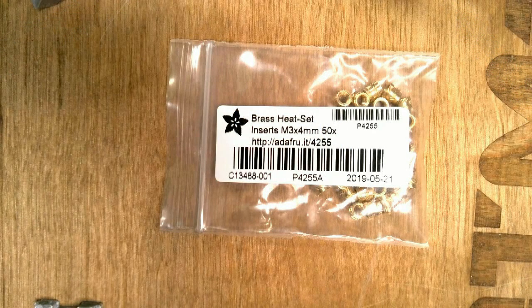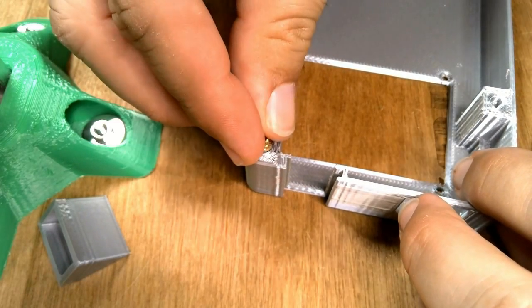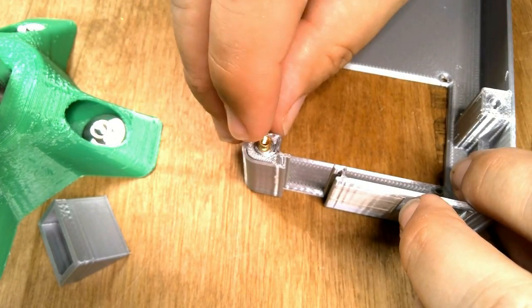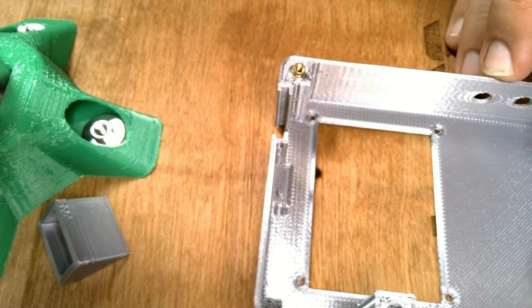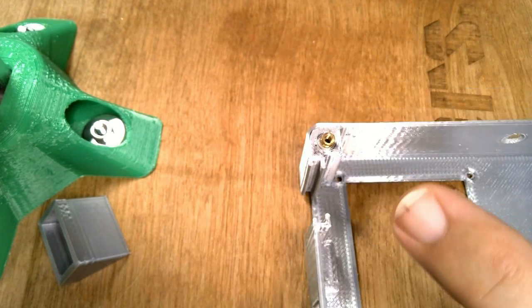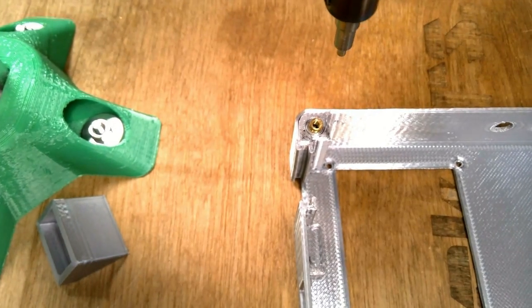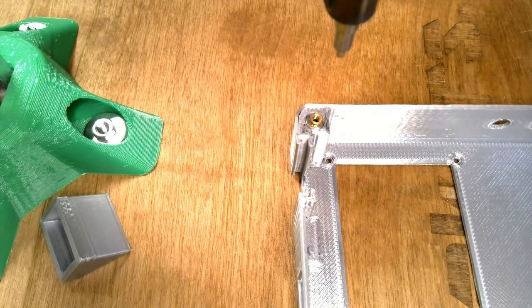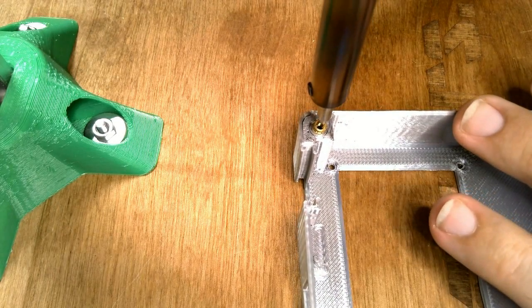We will prepare the case by inserting 4 of these brass heat-set inserts for M3 screws. The inserts go in 4 locations on the case. Press the brass insert into the hole in the case, and then, using a hot soldering iron with a special heat-set insert tip, press it into the case. If your soldering iron is too hot, try unplugging it and letting it cool for a minute, and then press the insert into place.